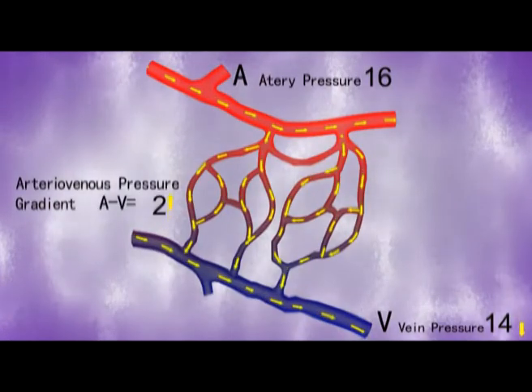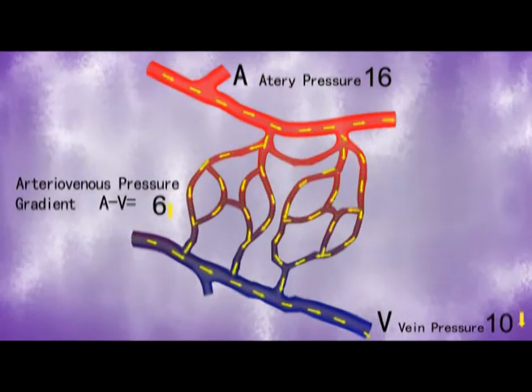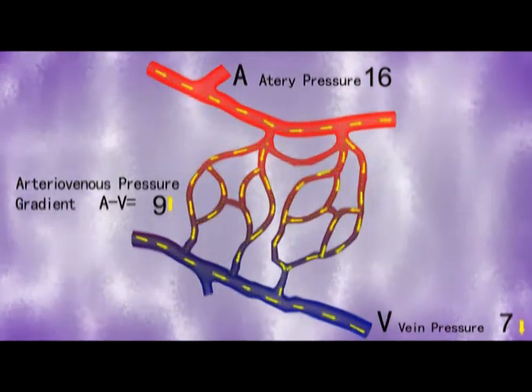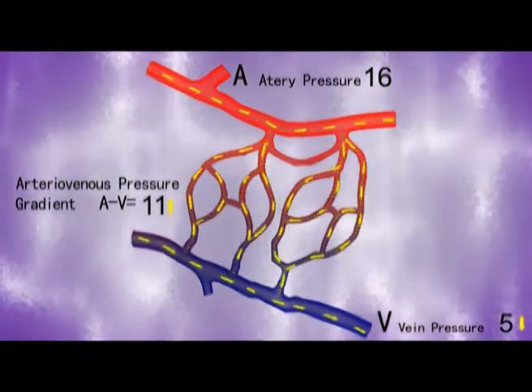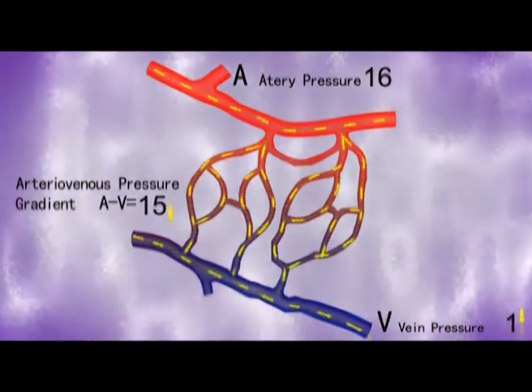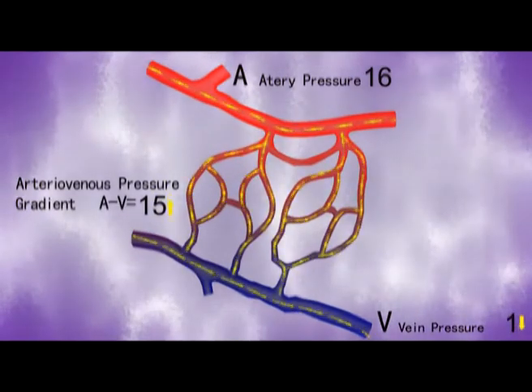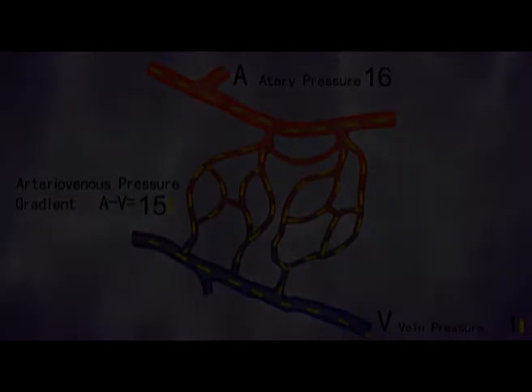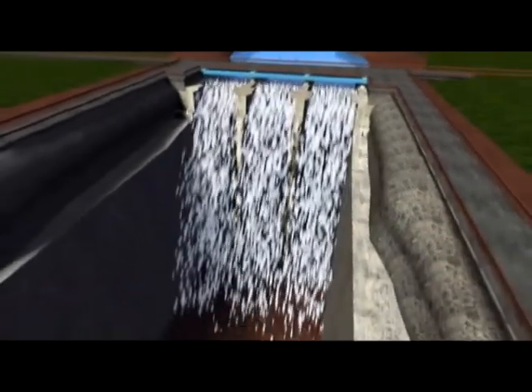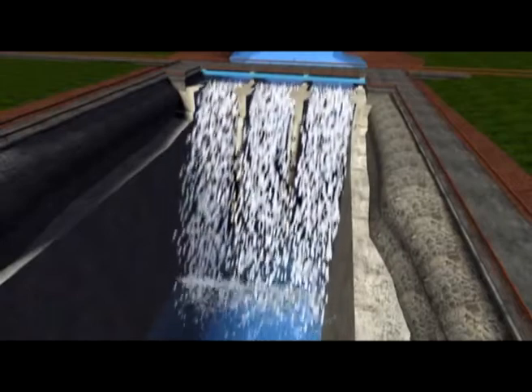By accelerating venous return, the AV foot pump reduces the venous pressure to compensate for the decreased arterial pressure, causing the arteriovenous pressure gradient to increase. Because of a greater arteriovenous pressure gradient, better arterial perfusion comes and the ischemic limb is improved. As a metaphor, imagine a series of small streams gradually getting closer, until they join and form a great big reservoir.